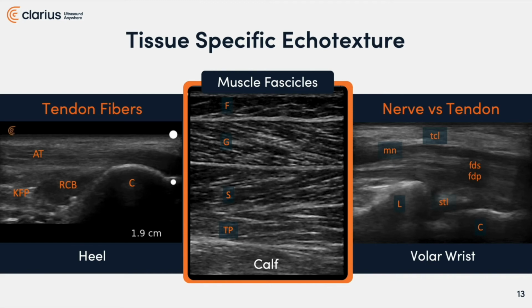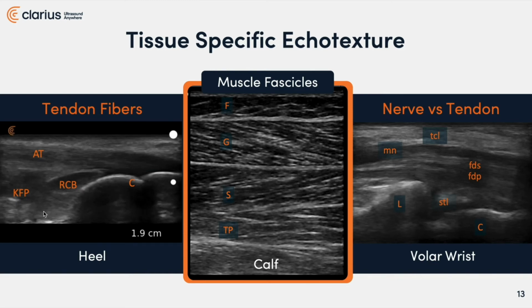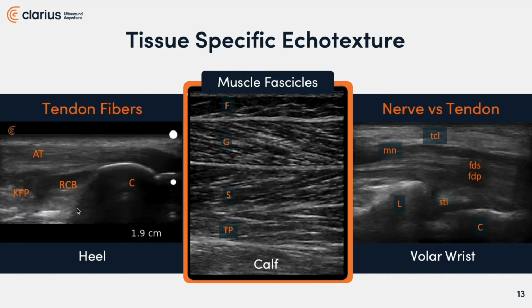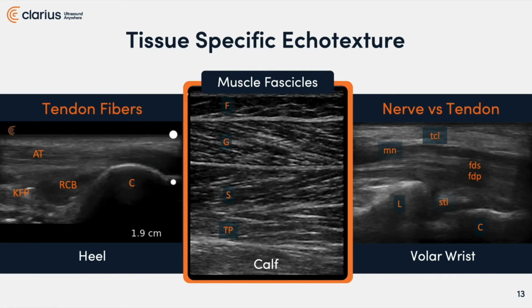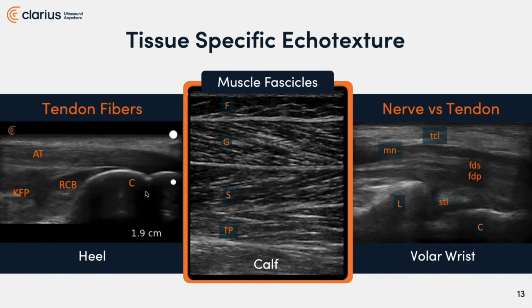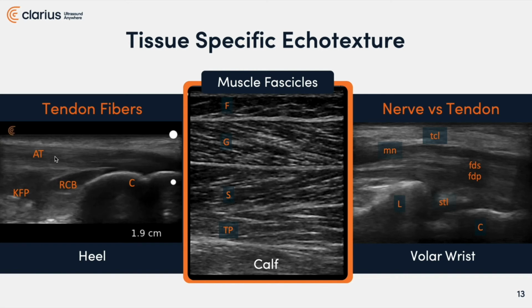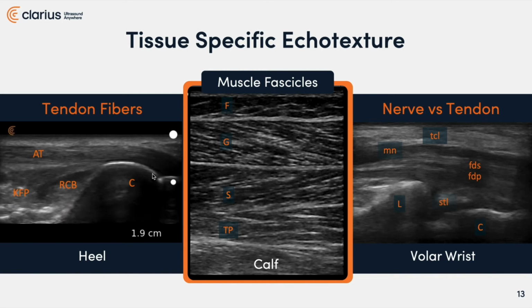But I want to show you. If you look close at what is happening here, I'm taking my foot into plantar flexion, and as I do that, the fluid from this bursa goes in and bathes that. Now I'm going back into neutral or dorsiflexion. Again, I'm going to take this down into plantar flexion. You'll see that it goes down. The Achilles tendon pulls up, lubricant goes in, and that comes back down.